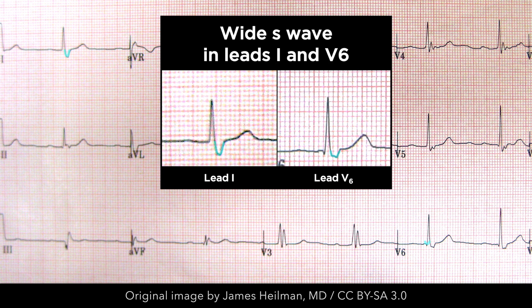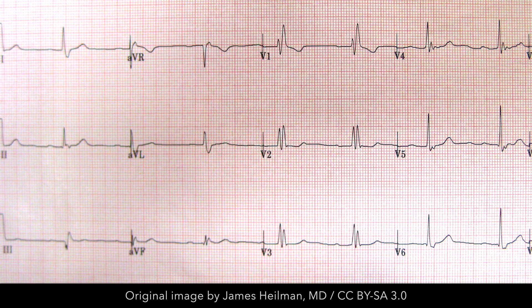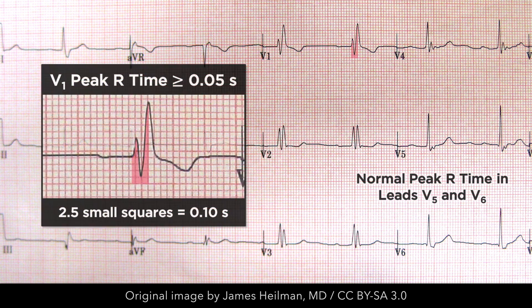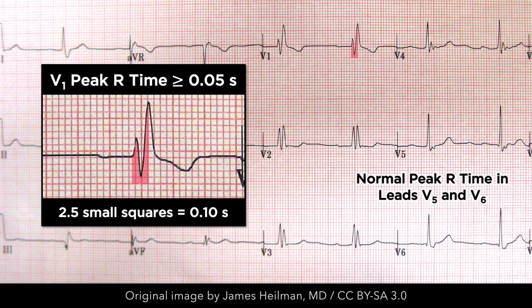The QRS complexes in left-sided leads have a broad or slurred S-wave, which is greater in duration than the preceding R-wave. The peak R-time in lead V1 is greater than 50 milliseconds, but normal in leads V5 and V6.